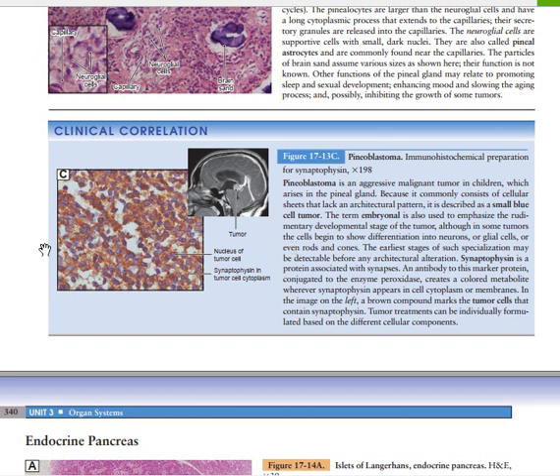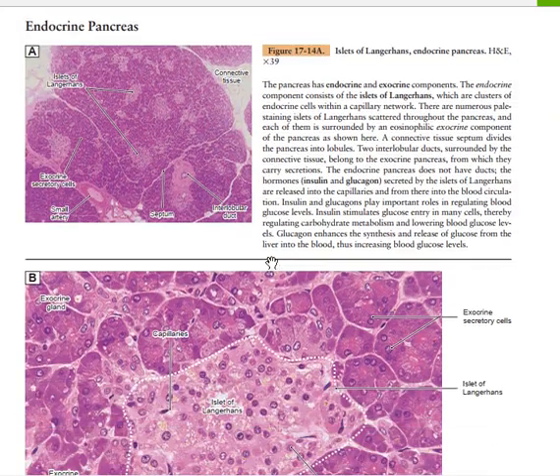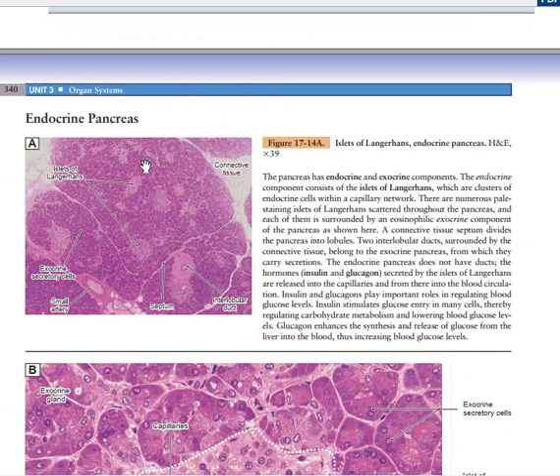So on the histologic section, what are you going to visualize? You're going to visualize the nucleus of the tumor cell, and you have synaptophysin in the tumor cells. So those are the different things you visualize. Then the last thing to visualize of the day is going to be the endocrine pancreas. For the endocrine pancreas, you need to know that it lies within the islets of Langerhans.